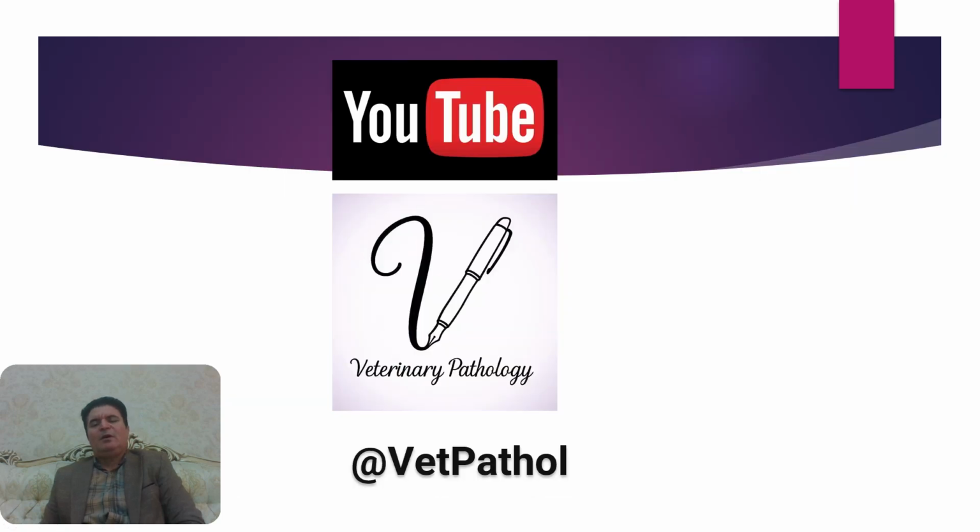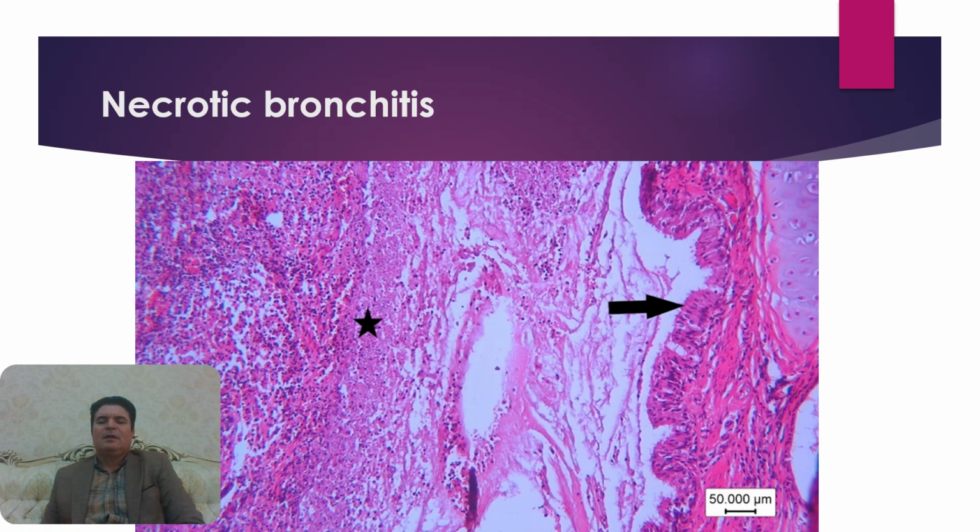When I examined histopathological slides of this case, it was really surprising. In this slide of the case, as you can see here, there is pseudostratified ciliated columnar epithelium of the bronchus.